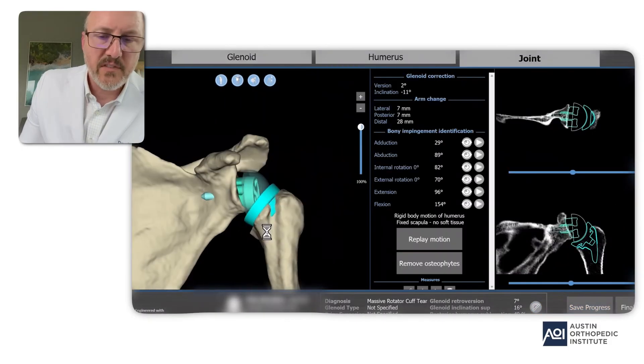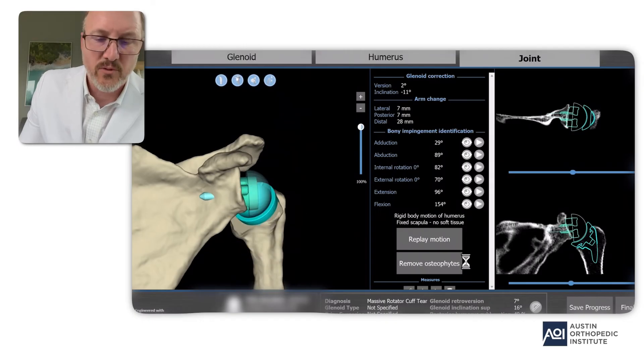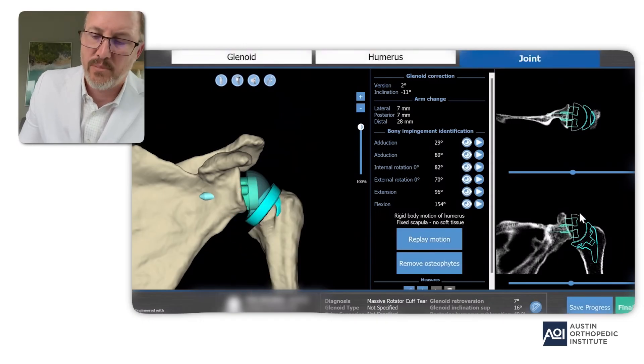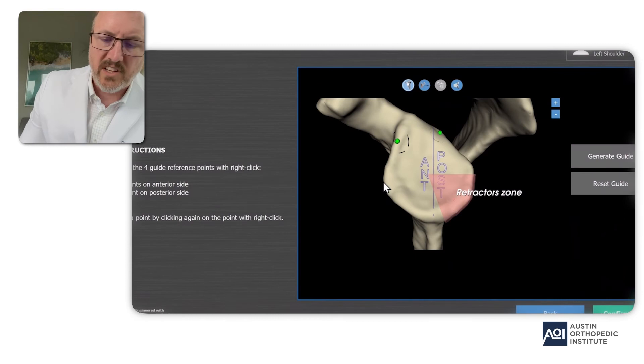In this part of the video you can see the shoulder joint going through a range of motions to test that it's not going to hit the bone anywhere. You can see in the bottom right the blueprint view and in the upper right the blueprint version showing the metal is well positioned. We like our final construct and we're ready to move on to generating the final guide.